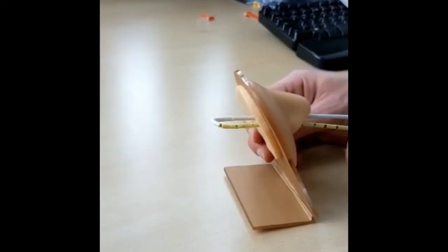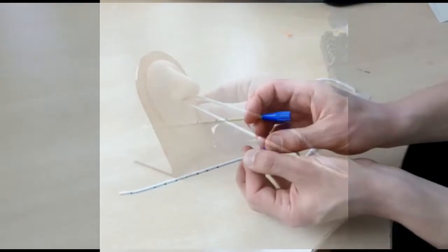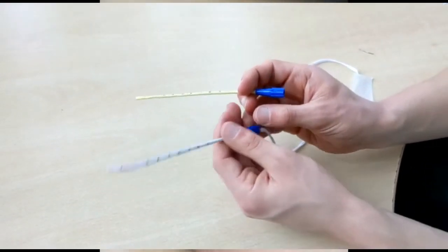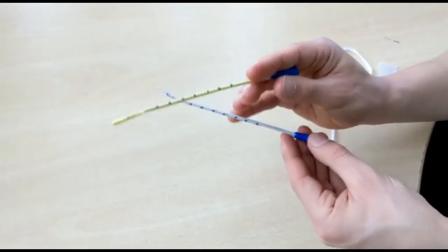The aim of the first part of the procedure is to connect the magnets on the end of each pole behind the nasal septum in the nasopharynx. To make this easier, bend each pole inwards keeping the numbered side on the outside. You can use the numbers on the side to ensure they are both inserted to the same depth.